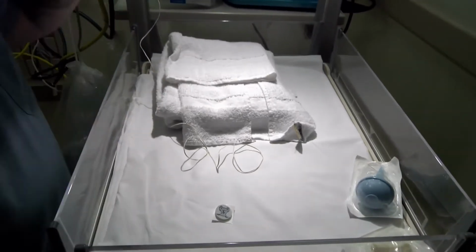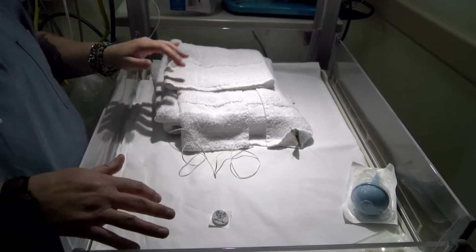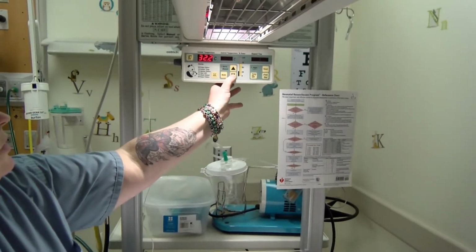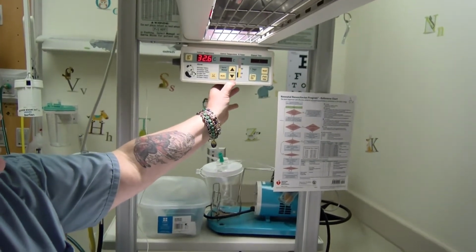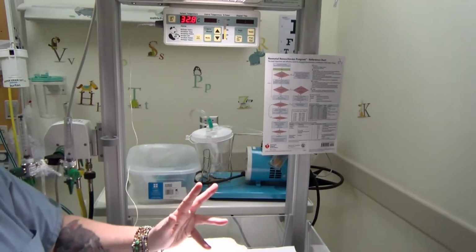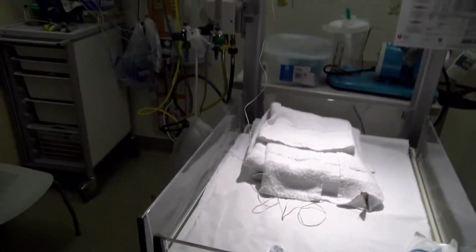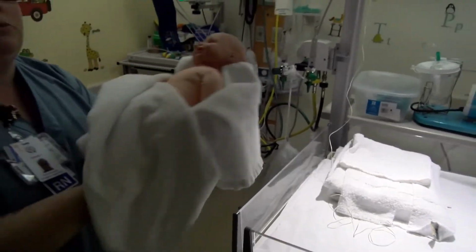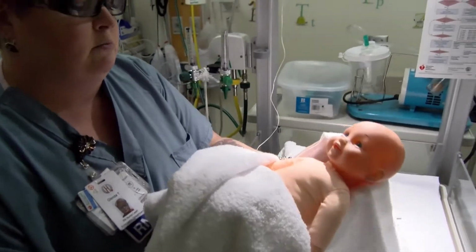And let's say it's been more than 10 minutes, the warmer is warmed up. Go ahead and just turn it down to about 50%, between 25 to 50%, just so it stays warm, since this is already really hot after about 10 minutes. When you get your delivery of your baby, you will be handed your wet infant. You will make sure you have your protective gear on, but for intents and purposes, we are just going to use this as a demonstration model.